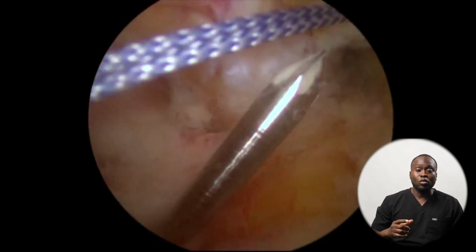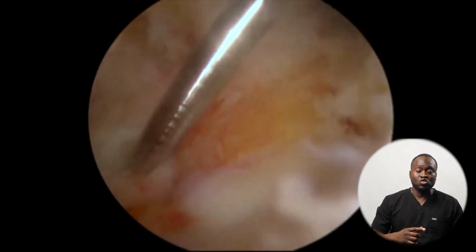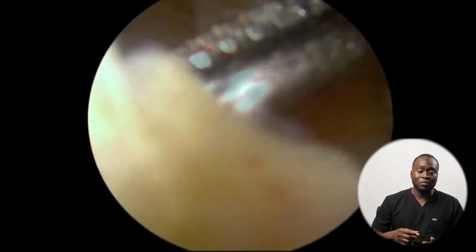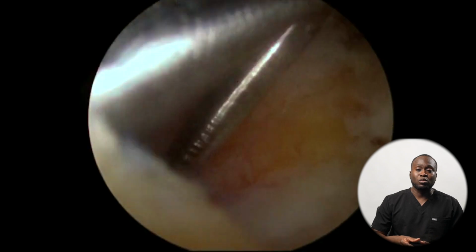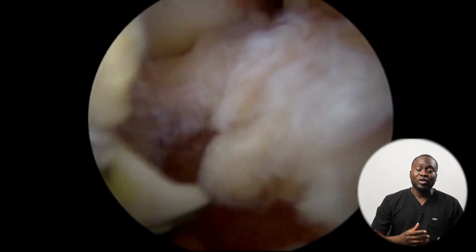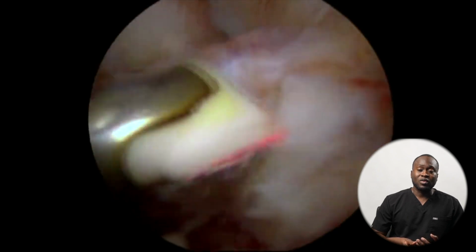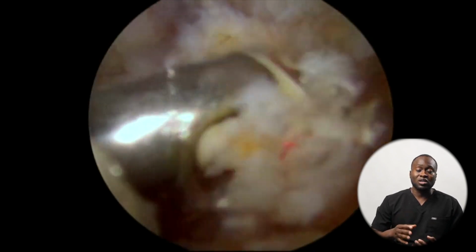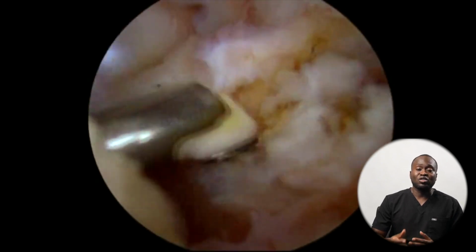So that tunnel going through the shin bone, through the tibia, is drilled the same way we did with the femur. And in both cases, we're drilling and then we're cleaning out the excess bone and debris from inside the joint because we don't want that to stay in there. We get that cleaned up and out of the way, and then we see that we have two clean, excellent tunnels in correct position.